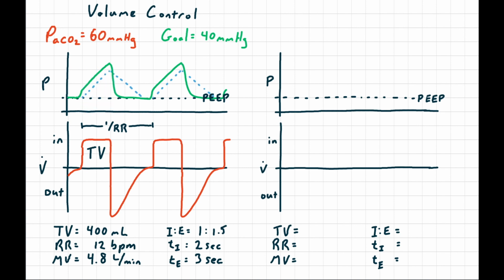To set the stage, let's say this patient is an otherwise healthy adult in their 40s who came in after a car accident. Unfortunately, the airbag failed to deploy and they smashed their face on the steering wheel. They had a CT scan and it doesn't look like there's any intracranial pathology, but they were intubated in the emergency department for airway protection because there are significant face and jaw injuries. So the lungs are healthy, the brain is healthy, but the patient is paralyzed, sedated, and intubated because of the risk of bleeding into the airway.